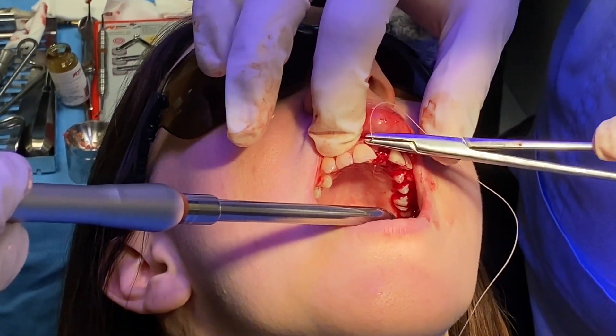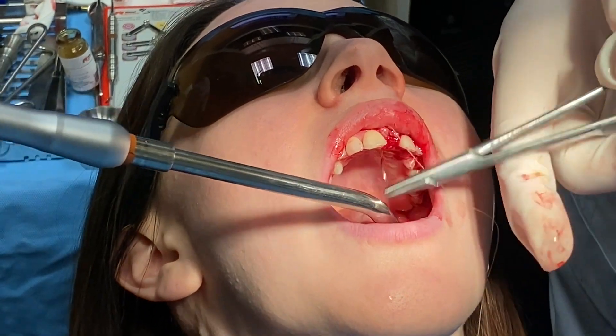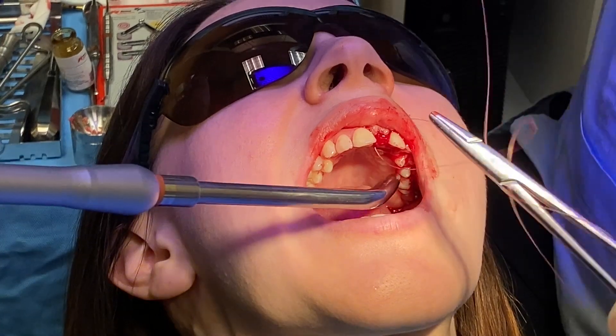We'll put the suture in and then let the patient wear a temporary that's going to go over top of this. She'll be wearing an Essex appliance, which will kind of keep the shape a little bit.